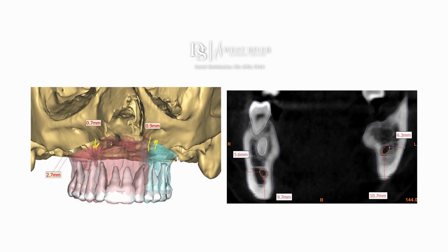Using these tools, we know exactly where the nerves are, where we make our cuts so that we avoid the nerves, where these lie relative to the teeth and the sagittal split as well. And with segmentation, even with custom plates now, I've been using a splint like this that is really well tolerated postoperatively and helps maintain the occlusion in its transverse position postoperatively.